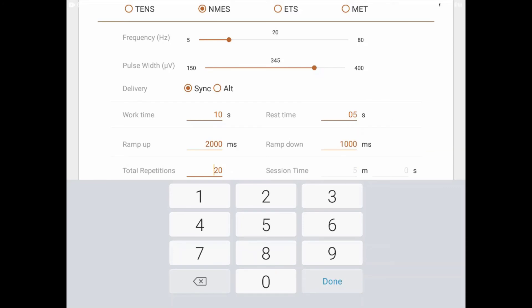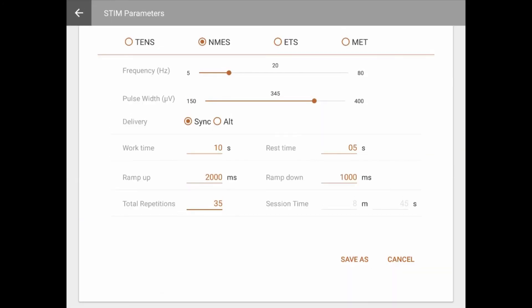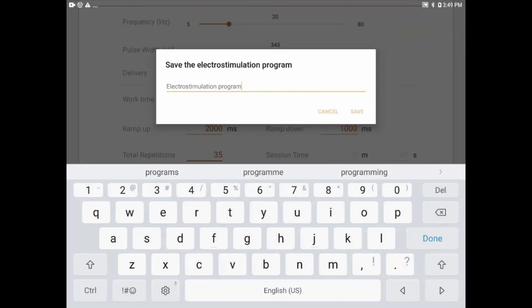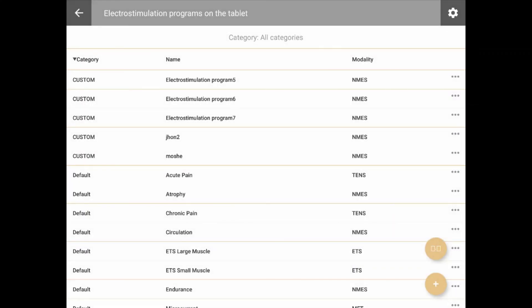NMES programs can be delivered in synchronous, where all channels work together and rest simultaneously, or in alternating, where odd channels work while even channels rest and vice versa. This is useful for antagonist muscle or reciprocal motion. After all settings have been applied, you may save the session. Note that you cannot override default or built-in programs — only save them under a new name by clicking Save As. Custom programs may be edited and overridden.